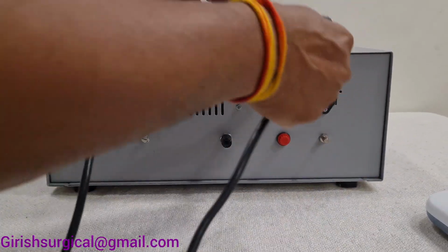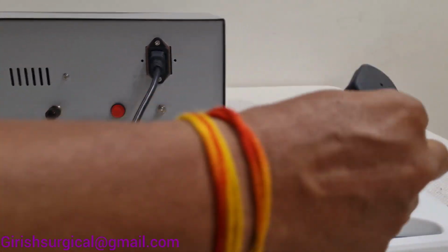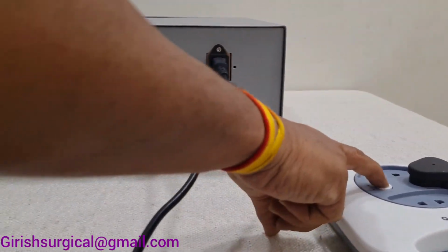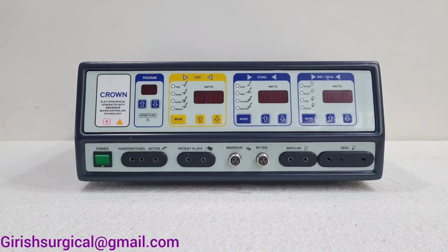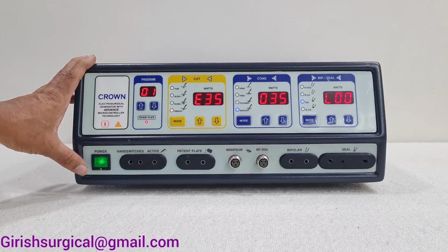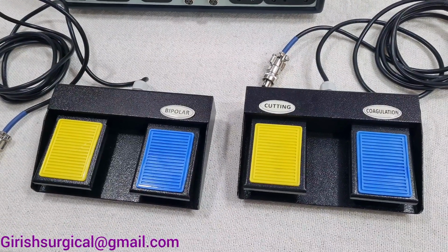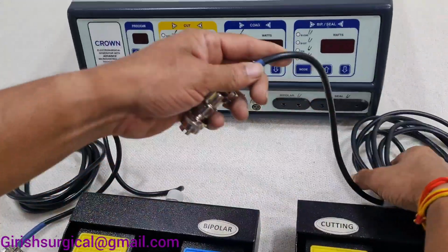Put the mains cord into the machine. This 3-pin plug goes to the main electric board. Put on the switch. Now we have put on the machine. Now we will be connecting the foot switch, the monopolar foot switch, which is for cutting and coagulation.